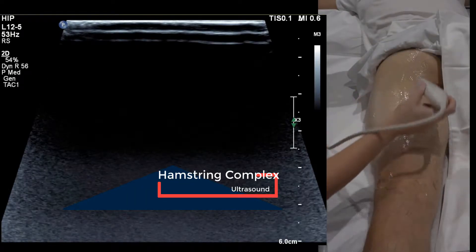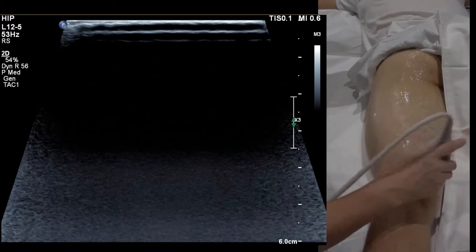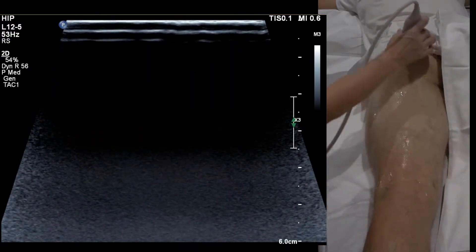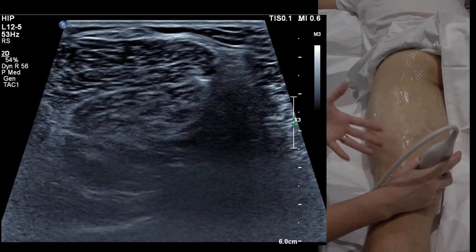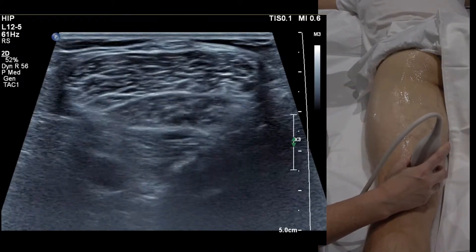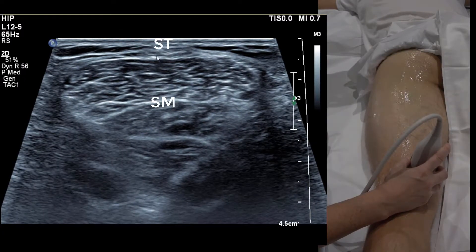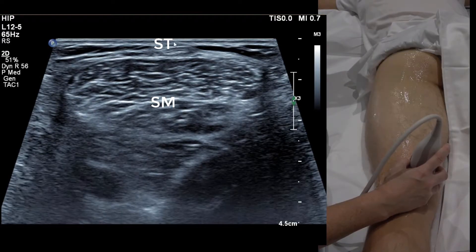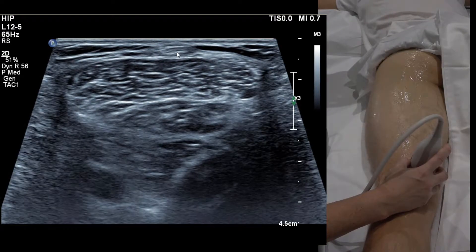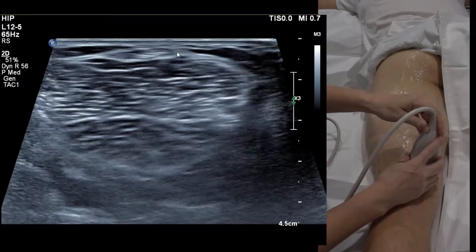Regardless of where the hamstring injury or bruising is, always orientate by starting at the knee and working your way up. The easiest place to identify hamstrings is to start medially. Most people are familiar with looking for Baker's cyst if you've studied knee ultrasound. So this is our semimembranosus and the little semitendinosus that sits on top — about a hand span above the knee crease.